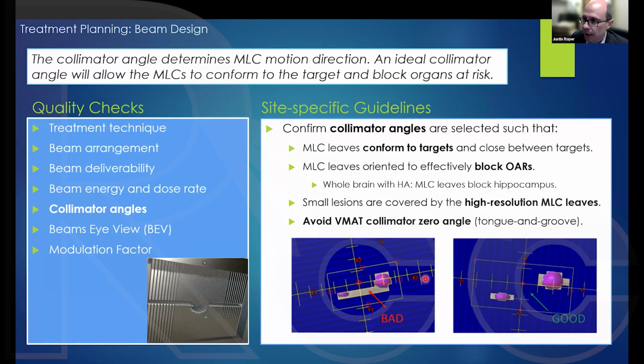Dr. Lee, does your practice vary? Don't for SRS, but if there's a lesion that's nearby, you could certainly contour. I mean, we do Gamma Knife, so it has a very steep dose fall off regardless of how we're doing it. So for LINAC, it may be different. That makes sense. We'll put limits for serial structures that we're worried about, like optic nerves, or we'll prescribe to a lower dose if it's in an eloquent area.